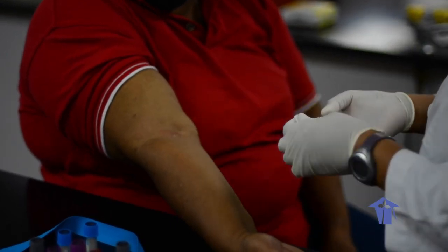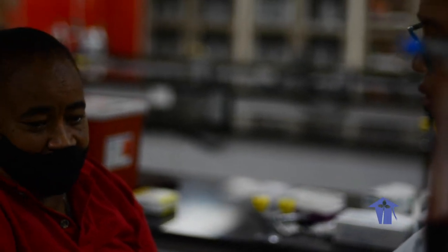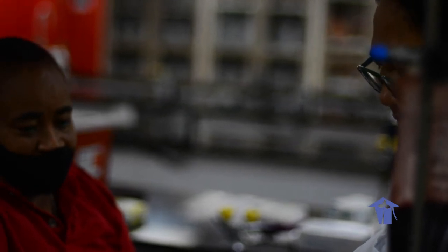We also have to thank the patient, so that's thank you for being a very good patient today. And we will send your specimens to the laboratory, and we will be getting a call to say that they are ready. Okay, and don't carry any heavy materials or anything like that at this time. Okay. Thank you.